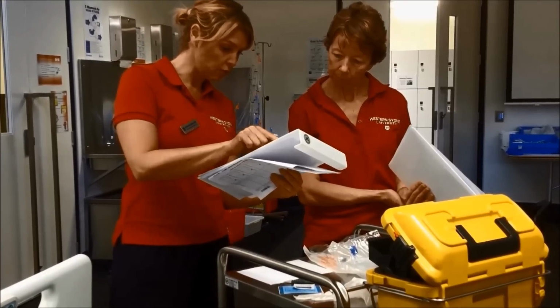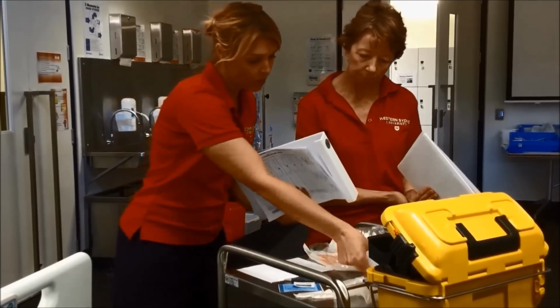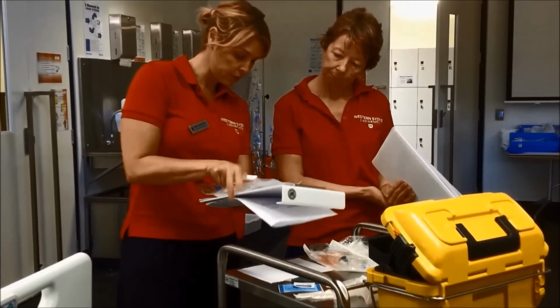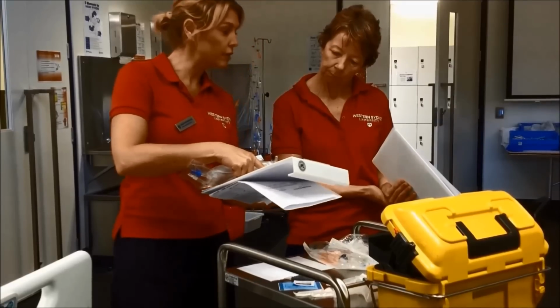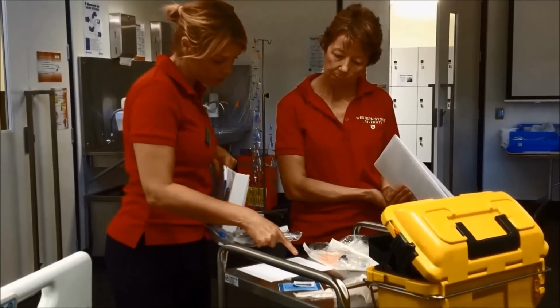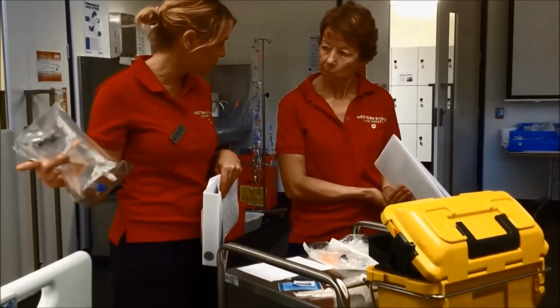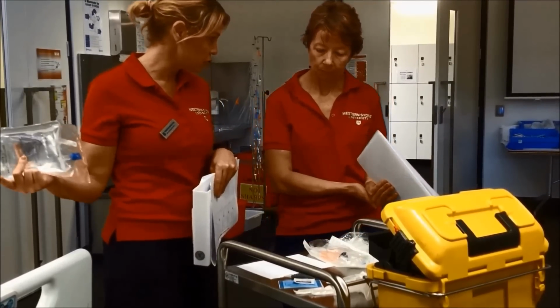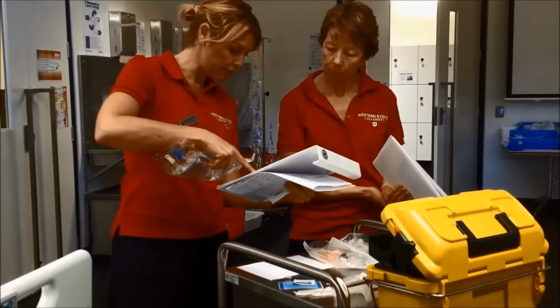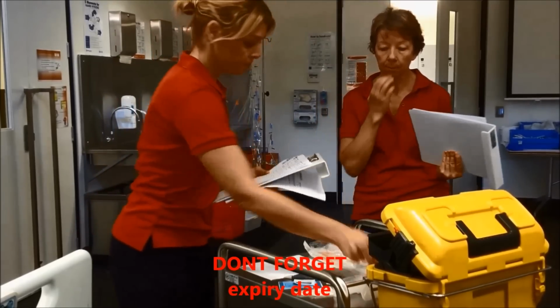Date of birth's correct, 1st of the 3rd 45, MRN's correct, 72 Dry Avenue, Somersville, again no allergies. So we have today's date, normal saline, 500 mils. The duration after I've given the 1 hour dose will be 4th hourly. And I've worked out for the 1 hour dose, I'm going to give it at 100 mils per hour. I'm going to use a pump so that it doesn't go through too fast, because there are side effects that could affect him if it goes through too fast. It's signed and printed by the doctor. It hasn't been given, and it's an IV order. Expiry date is 2018. Okay, now I'm going to just draw up my drug.